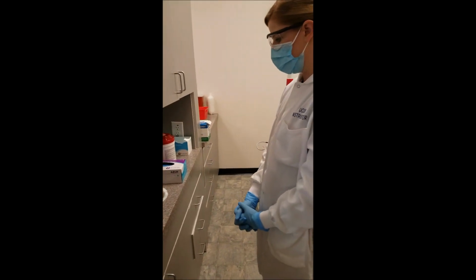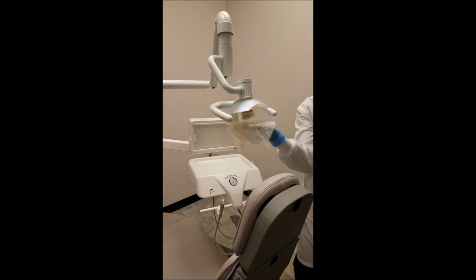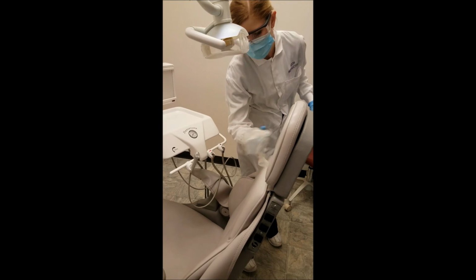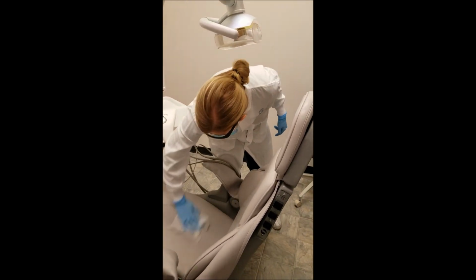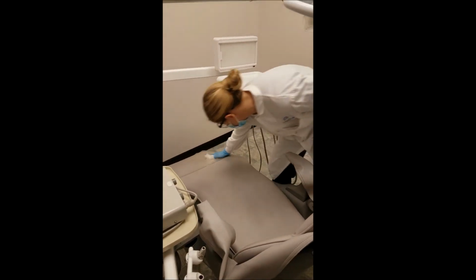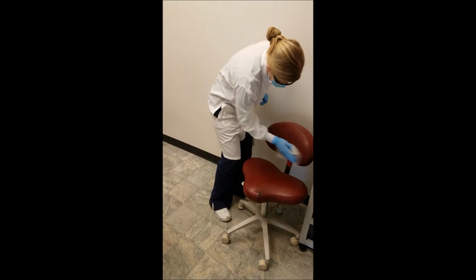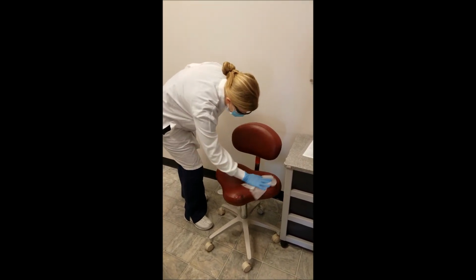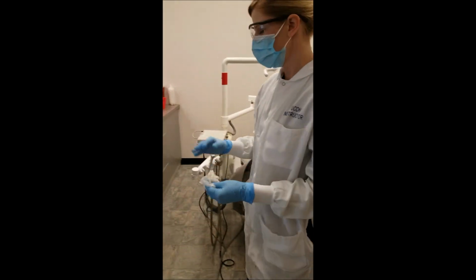Then she will use the damp paper towel to dust the light shield, the lowered patient chair, and then the operator chair in a top to bottom method. That's the patient chair and then the operator chair. Helpful hint, she is making sure not to touch the clean parts of the chair with her other glove. And then she will dispose of that.